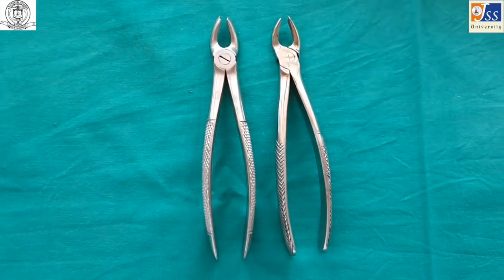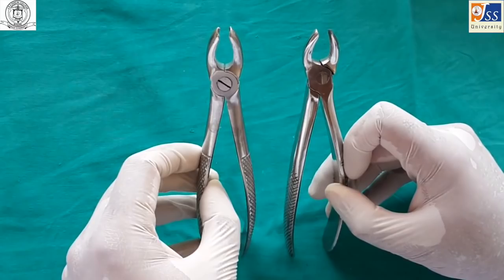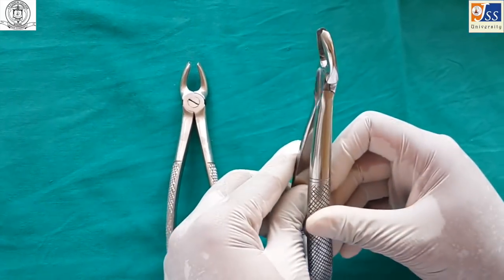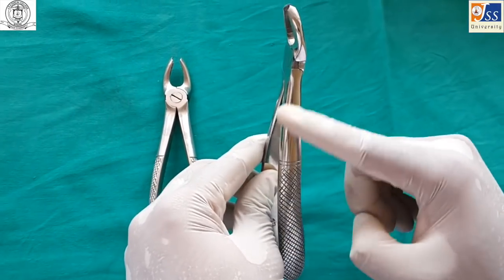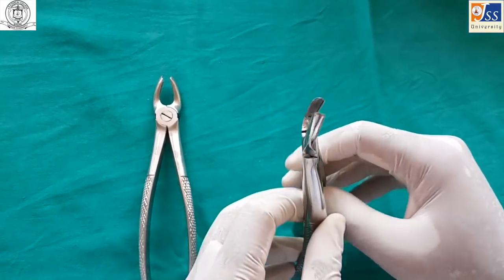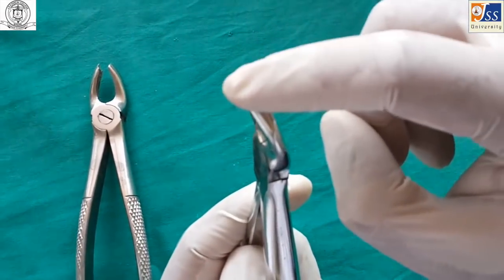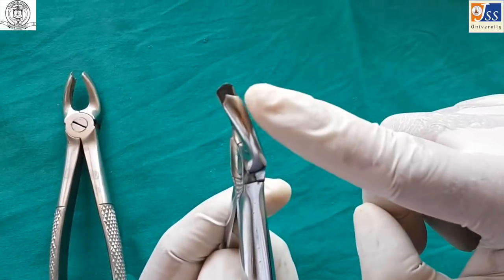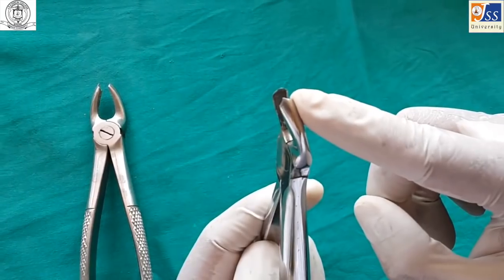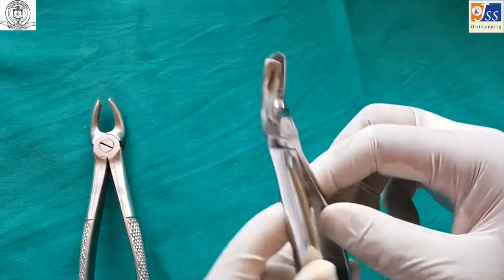The maxillary molar forceps is used for maxillary molars. It is a paired instrument — one for the left and one for the right side. It has a pointed end on one beak which engages the buccal furcation area, which determines the side of the forceps. The other beak is smooth and slightly curved to engage the palatal root.